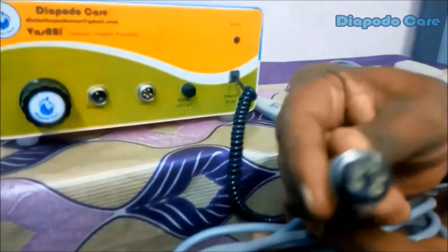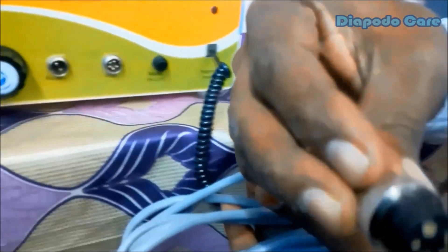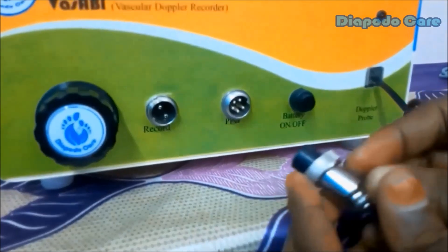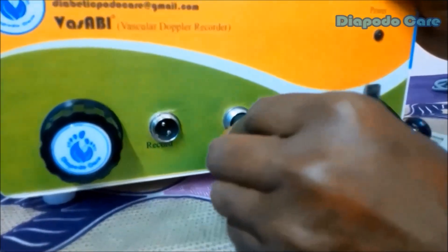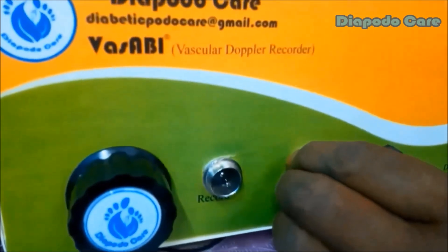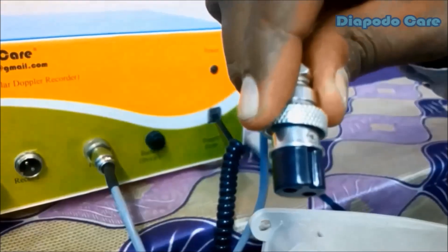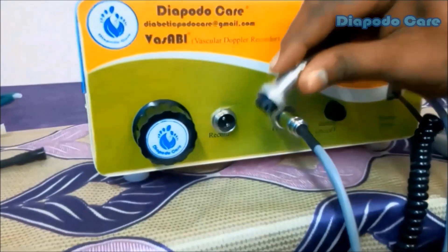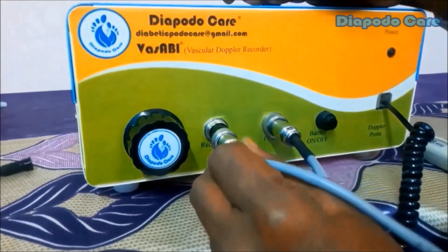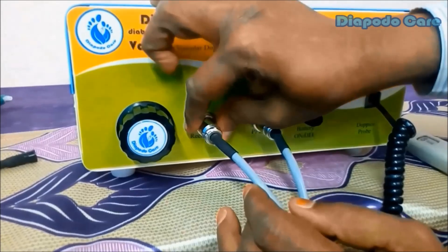After connecting the ultrasound probe, we need to connect the PPG probe with the main unit. Find the 5-pin female connector with a dent on the main unit and make sure the dent of the male and female connectors match. Finally, connect the record foot switch with the main unit using the 2-pin female connector marked as 'record', again ensuring the dents of male and female connectors match.